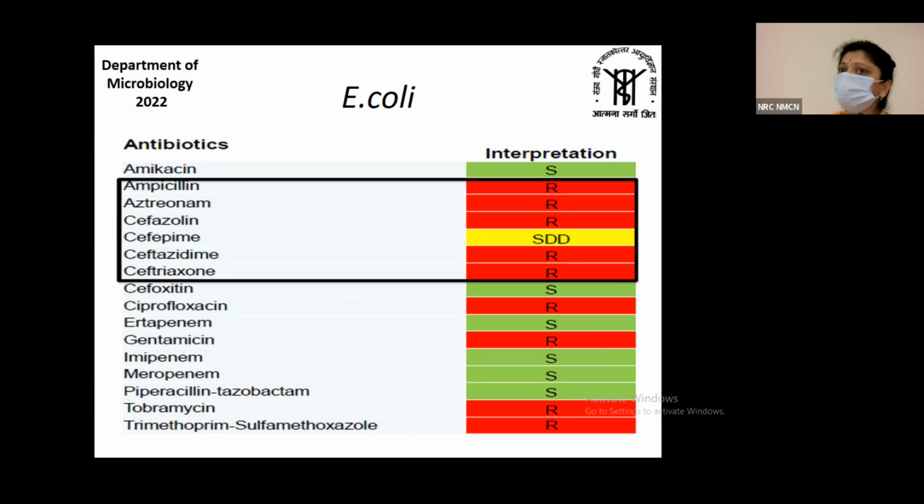Now, sadly, what is the problem? We have very few oral agents now in this antibiogram. I have deliberately omitted fosfomycin. Fosfomycin ideally is a restricted class of antibiotic. So whatever I have to manage the UTI, I have to manage my UTI with these agents only, by and large. Okay. So till now, I hope I am clear. Do you have any doubts regarding this?